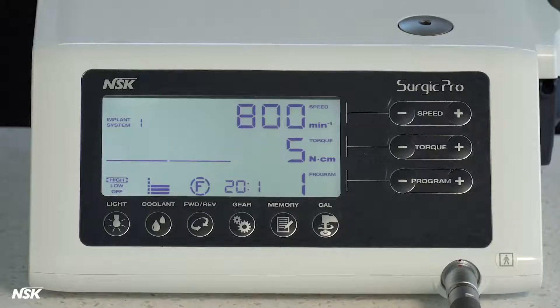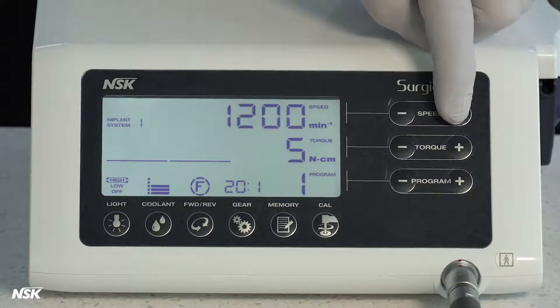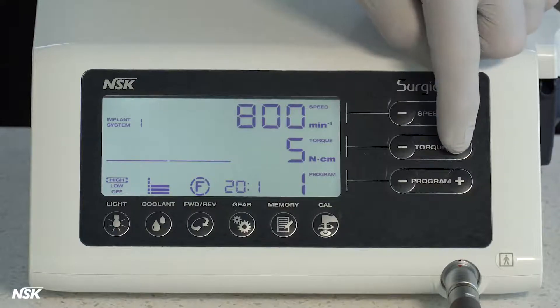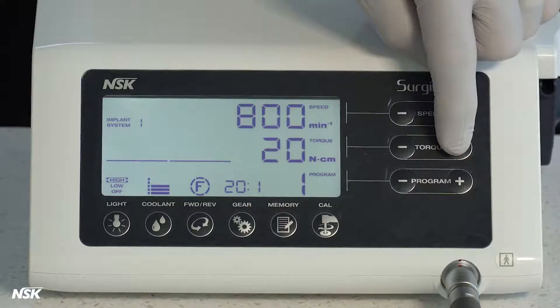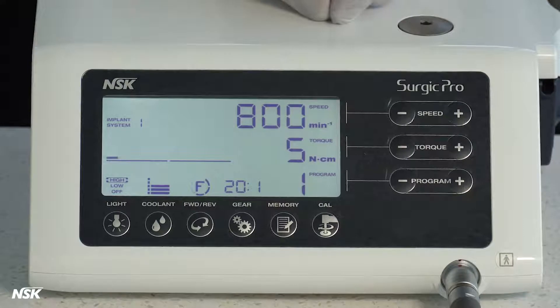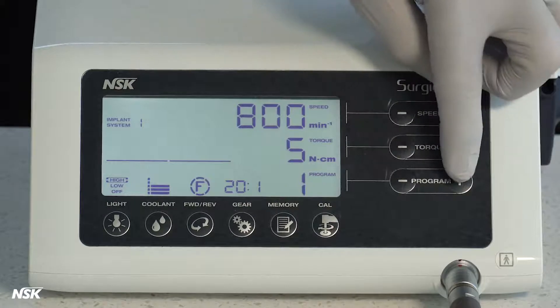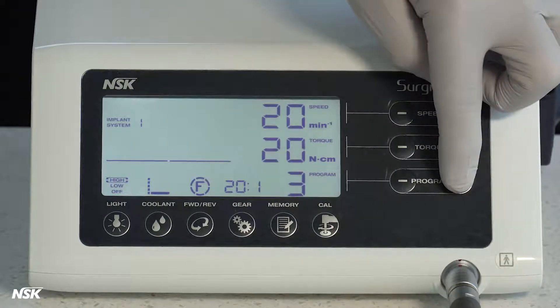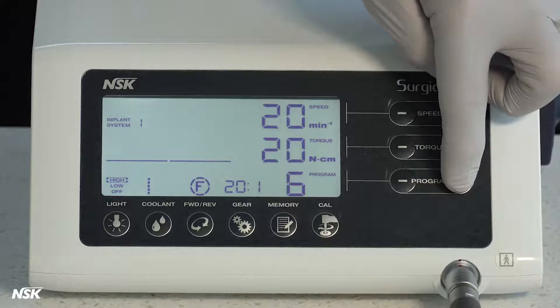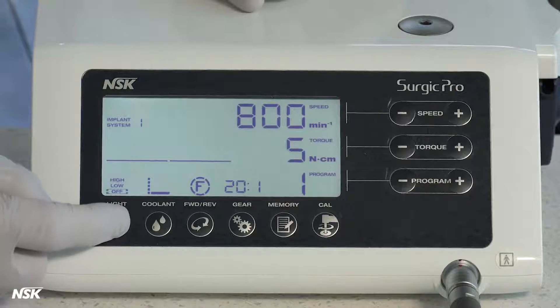Now let's review the touch panel on the front of the unit and its control buttons. Speed buttons are used to adjust the rotation speed. Torque buttons are used to change or set the torque values between 5 and 80 Newton centimeters for implant attachments. You will notice the amount of bone resistance applied to the drill is displayed like a graph during operation. Program buttons will select any of eight programs in each of eight implant systems. Light button sets the display light brightness levels; this only applies to the Surgic Pro with LED optic motor.